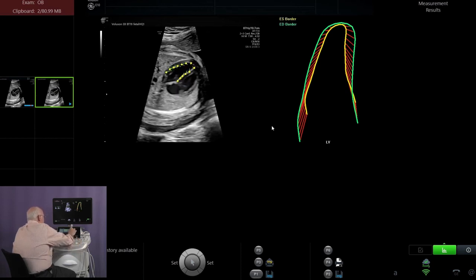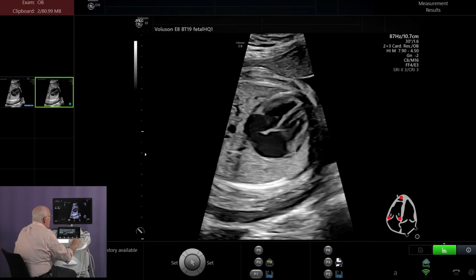We're now going to go to the right ventricle. And again, it asks us to touch the red dots at septal wall, lateral wall, apex. We'll do that right now. Here's the septal wall, here's the lateral wall, and this is the apex. We're going to do a little adjustment and bring these dots into the septum.